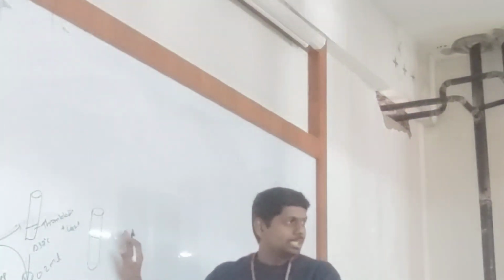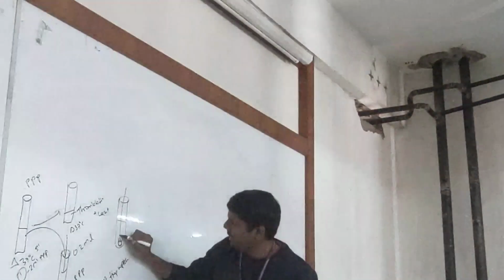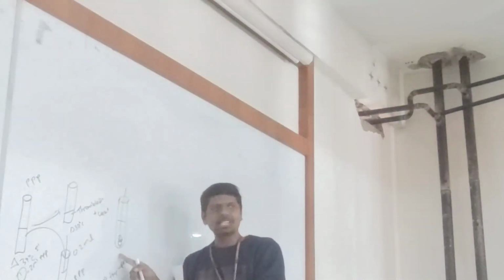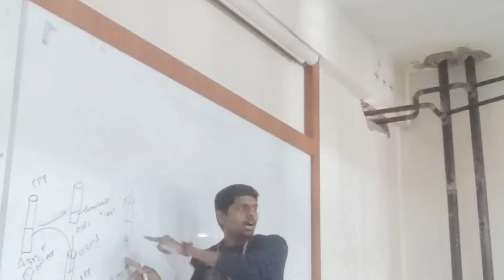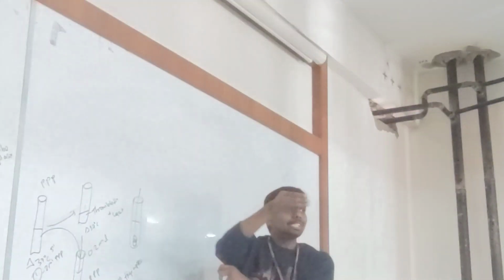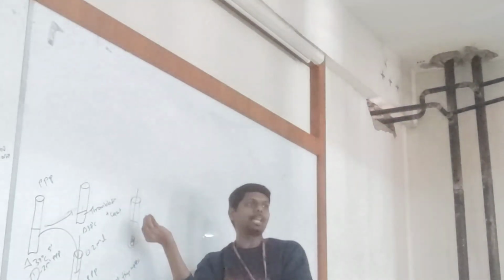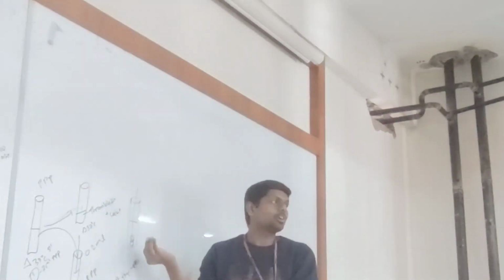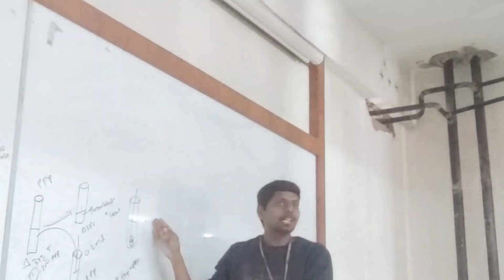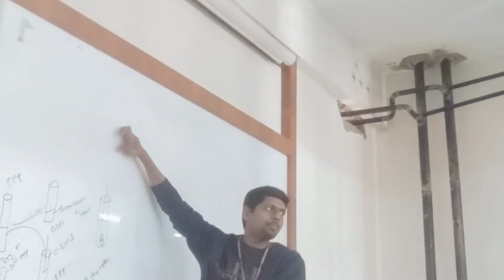Not in all textbooks. I saw in some textbooks they took a looped wire and already kept the looped wire in the test tube. After clotting happened, when you remove this wire, you will see a clotted mesh attached to the wire. That indicates whether it is clotted or not. So that will be another confirmation by lifting the looped wire up.